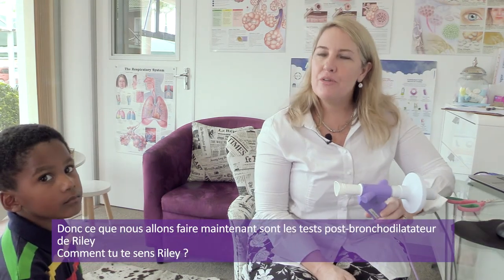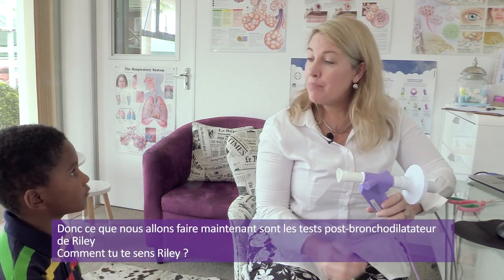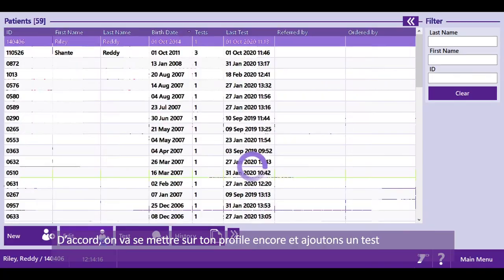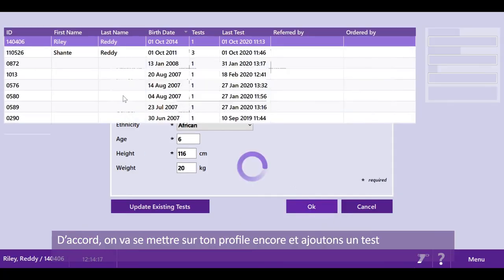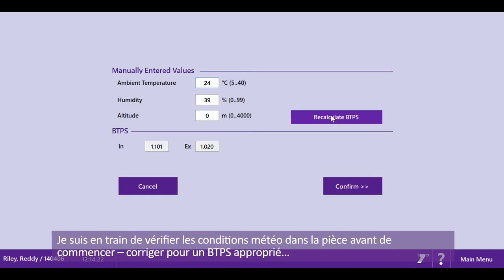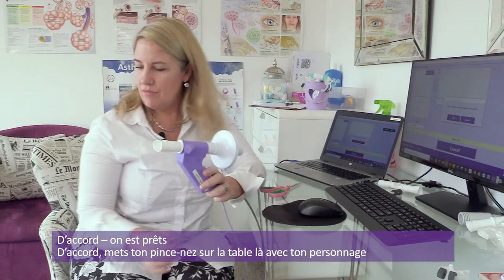So what we're going to do now is Riley's post-bronchodilator test. How are you feeling, Riley? Fine. Okay, no issues. Excellent. Right. So I'm going to call up your name again and let's add a test to this. I'm checking the weather conditions in the room before I start, making the correct BTPS correction. And right, we're ready to go.